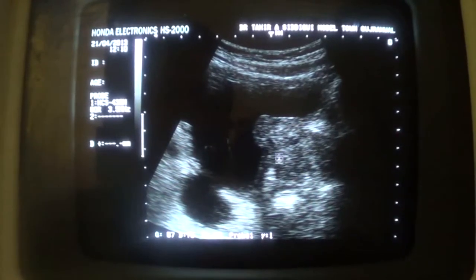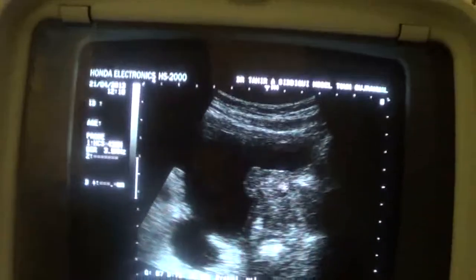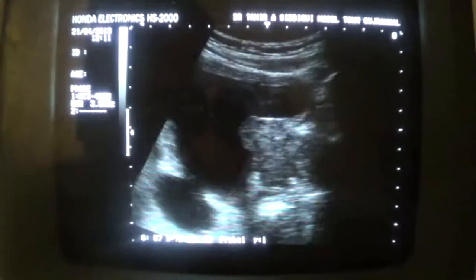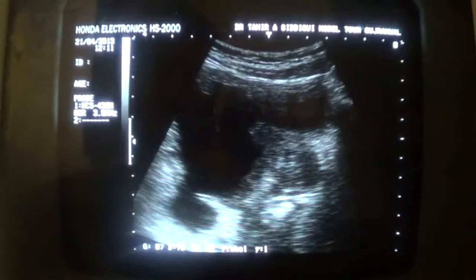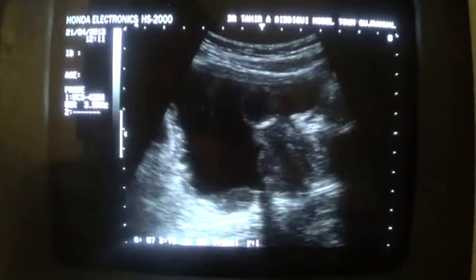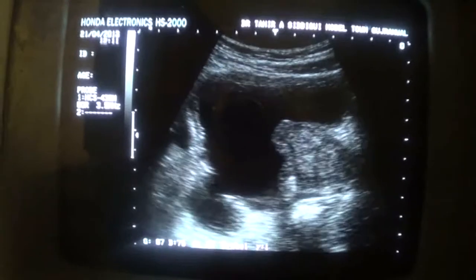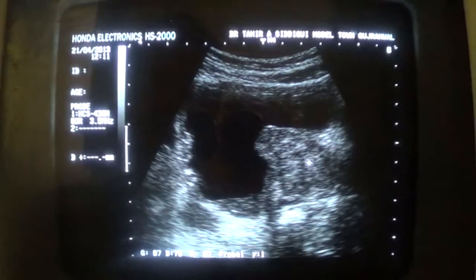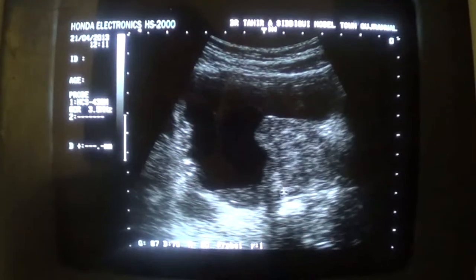This is the main gland of the prostate, and you can see a small ill-defined hyperechoic focal area, and you can see a few others. The prostate substance shows an inhomogeneous appearance with a few ill-defined hypoechoic as well as hyperechoic focal areas.